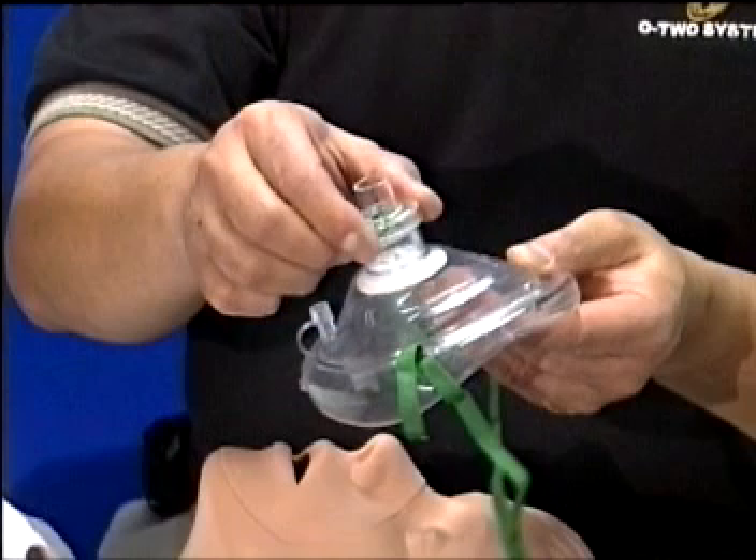The soft and pliable mask is not adversely affected by extremes of temperature. It is virtually indestructible due to its flexible design.